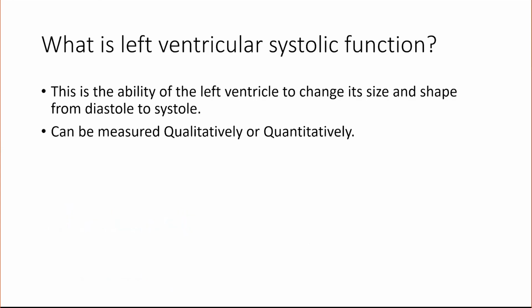Okay, so moving on to LV function. So what actually is the LV function? For the most part, mechanistically, it's the ability of the left ventricle to change its size and shape from diastole to systole. That's what we are measuring. And we can measure this qualitatively or quantitatively.